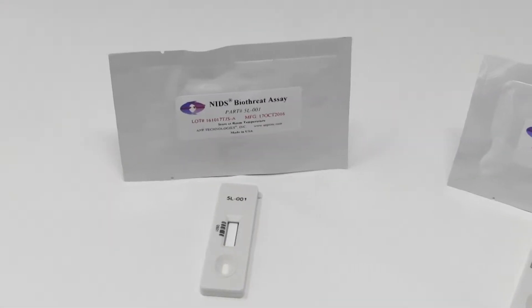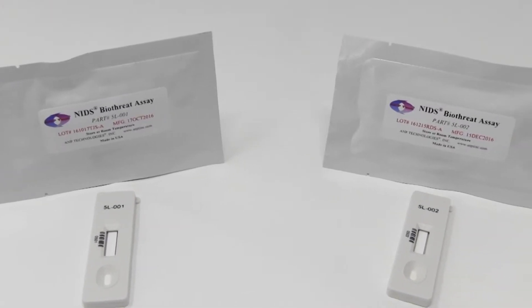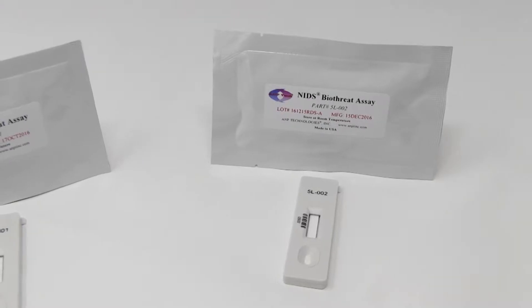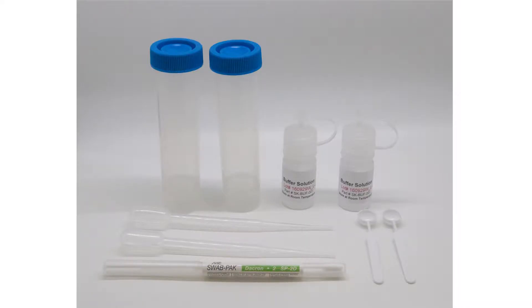The DoD-only system comes with 5L-001 and 5L-002. We recommend using our multi-purpose sampling kit, part number SK-001, for preparing various samples such as suspicious white powders or swabbing of surfaces, as these components and buffer solution are optimized for the NIDS multiplex assays.